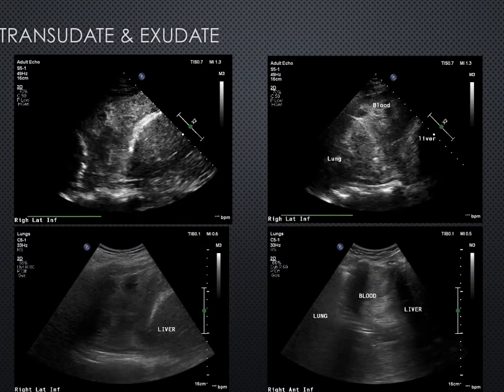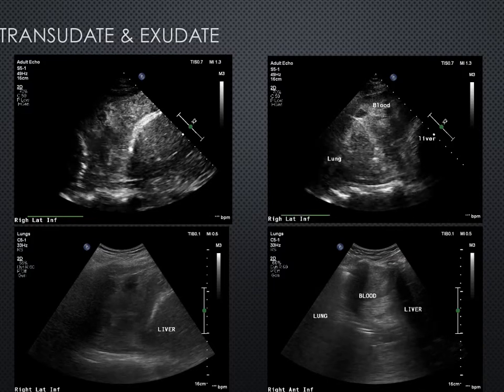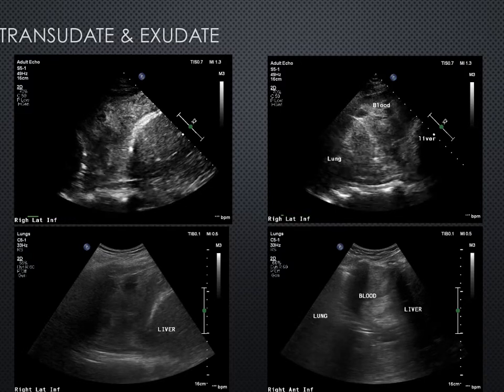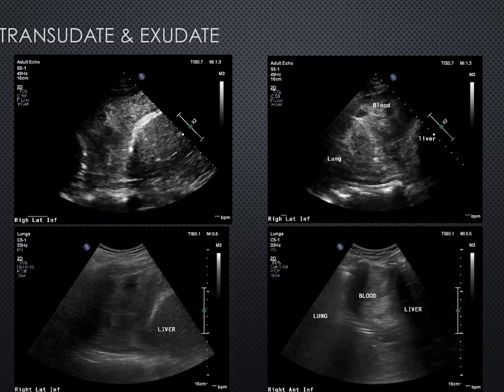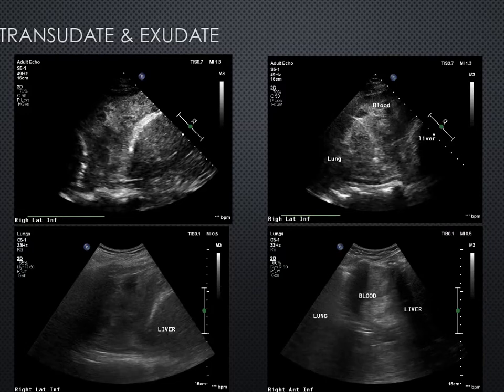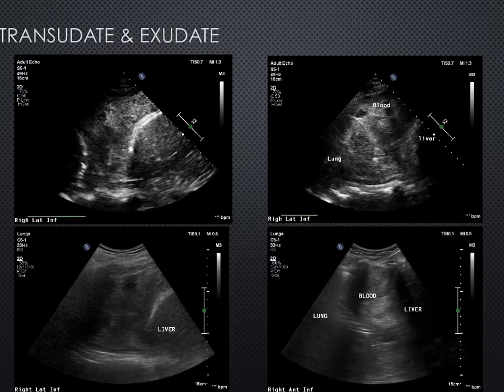And finally, just to finish off with some of the lovely images that I was showing you of pleural effusions, I think this is quite a nice case. This was an ECMO patient that we had that actually had a massive bleed within that thoracic cavity, and you can see that the density of that fluid, or what was fluid at one case, within that thoracic cavity has become very dense, echogenic, so that we can actually directly visualize it.